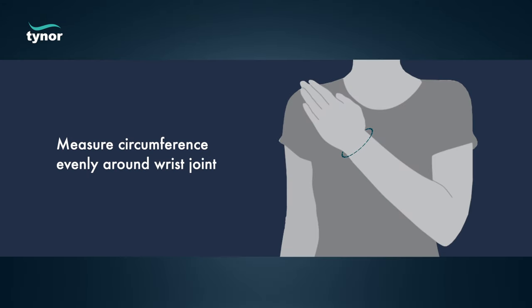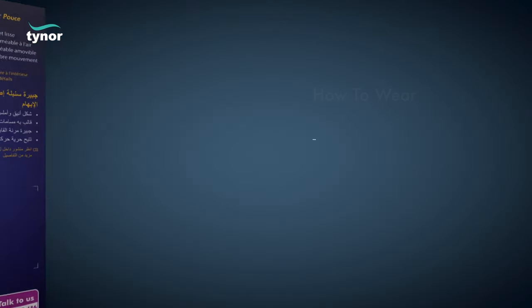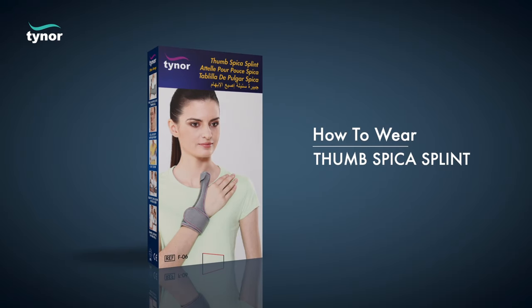Measure the circumference evenly around the wrist joint. Now let us see how to wear the thumb spica splint.